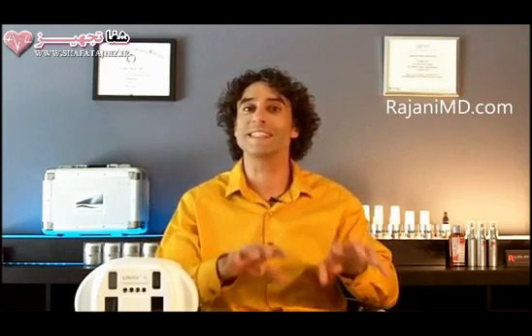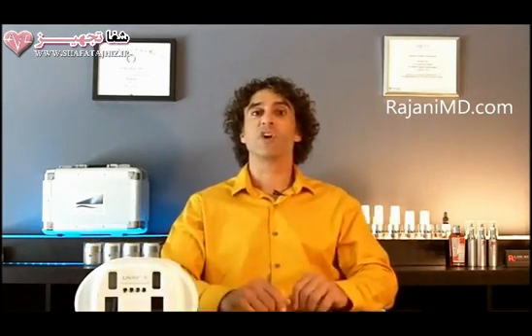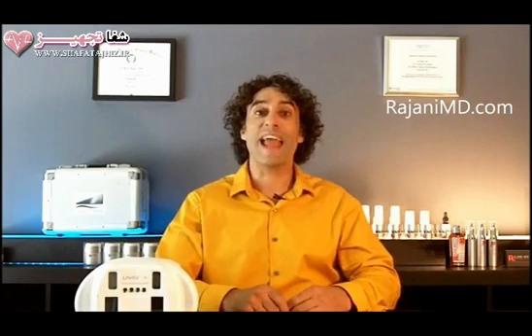So it allows you to use the tools that are already existing in your practice today, but use them more often, work smarter, not harder, because you're doing more on less patients, less numbers of patients. Part of the best part is you pay this off in weeks, not months or years. So it's an easy addition to any clinic.